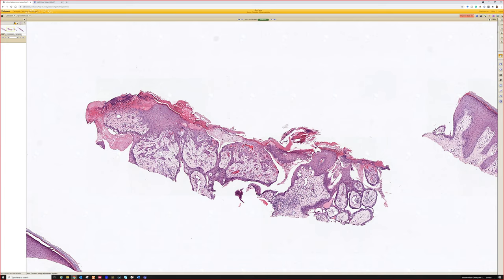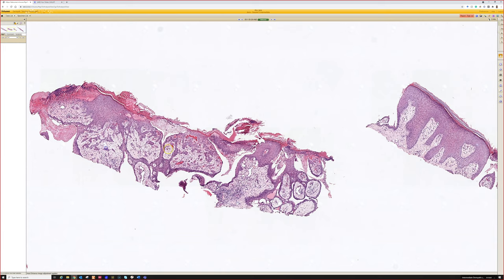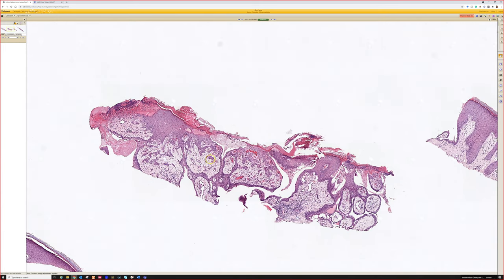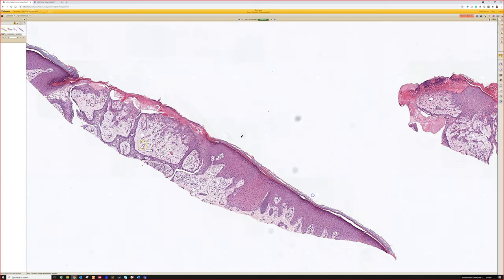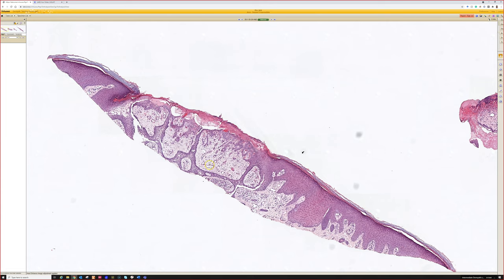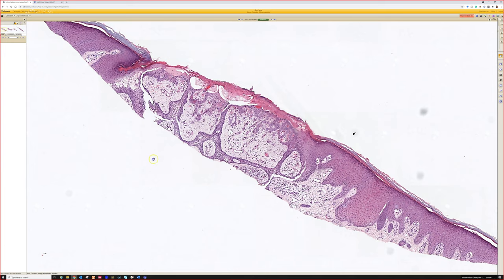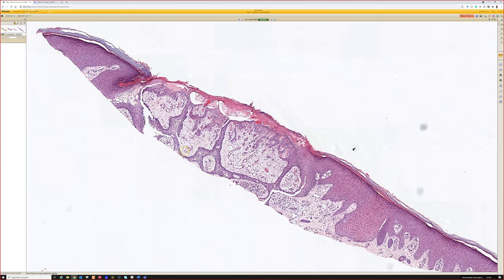Sometimes they can have a linear arrangement when they're multiple, which I think is where the nevus name came in, kind of like how epidermal nevus grows. I've only rarely seen these in practice, and you can see the same kind of appearance as a reactive phenomenon overlying other types of things. I feel like most often they are on the leg, but they've been described in a wide variety of sites.